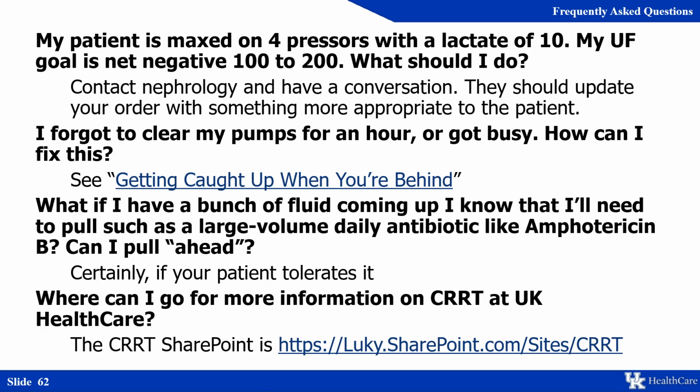Next question is, what if I have a bunch of fluid coming up that you know that you're going to need to pull, like amphotericin B, or maybe just anything that's a large volume? You can definitely pull ahead as long as your patient tolerates it. And if for whatever reason that antibiotic gets canceled or discontinued, you might pull a little bit less than your goal and let them catch back up.